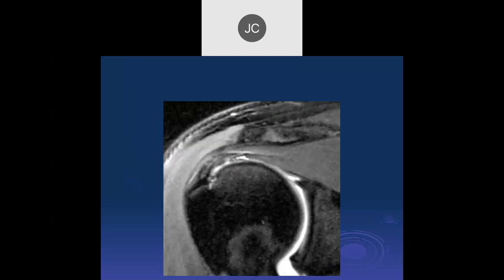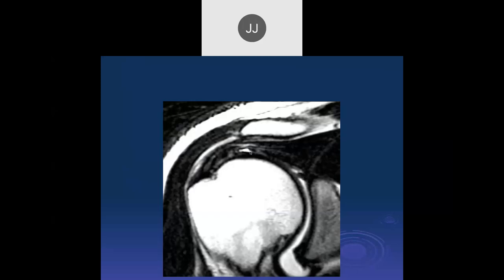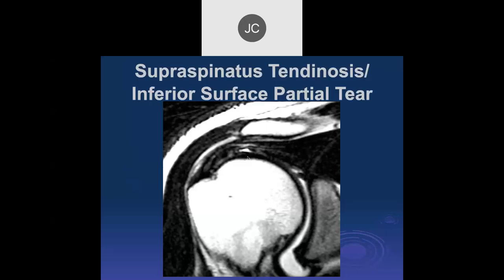Here's another cut. There's some signal getting closer to the musculotendinous junction near the articular surface — T2 bright. Another tear at the musculotendinous junction. So I think we're seeing low-grade partial tears of the joint side or inferior surface, and a little partial tear right at the musculotendinous junction. This is probably predominantly involving the tendon rather than the muscle like we saw before.